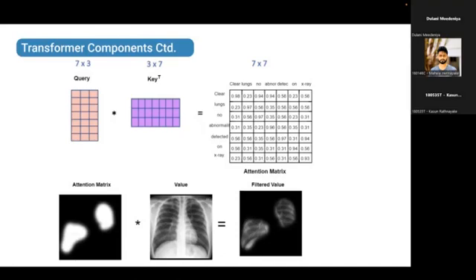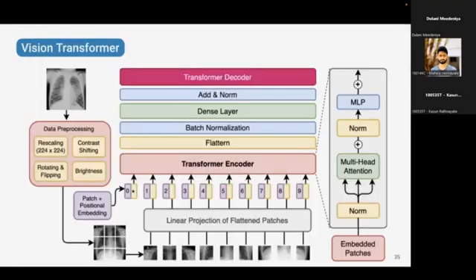So we can understand this better from these chest X-ray images. The first image works as an attention matrix, and using that matrix, this filtered part is generated with one attention head and passed to the decoder as the extracted feature. So there are multiple attention heads, as I mentioned earlier, which help us to focus on multiple parts in the image.